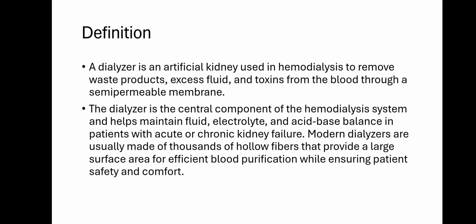The dialyzer is a central component of the hemodialysis system and it helps maintain fluid, electrolyte and acid-base balance in patients with acute or chronic kidney failure. Modern dialyzers are usually made up of thousands of hollow fibers that provide a large surface area for efficient blood purification, while ensuring the patient's safety and comfort.